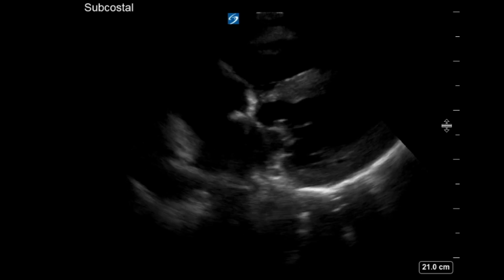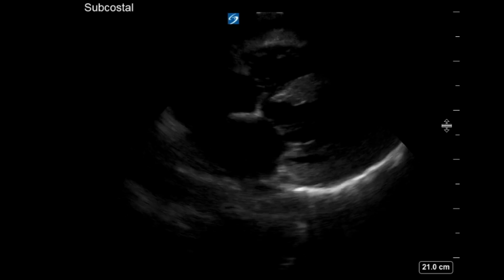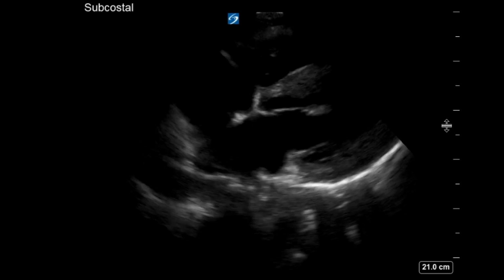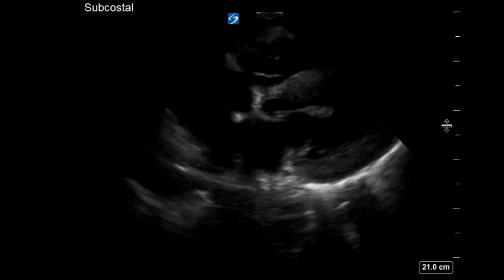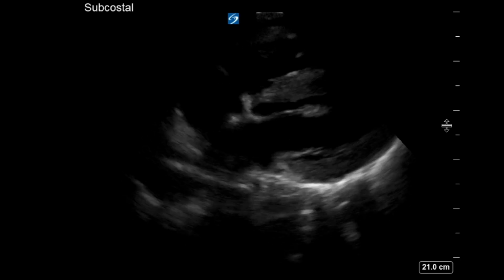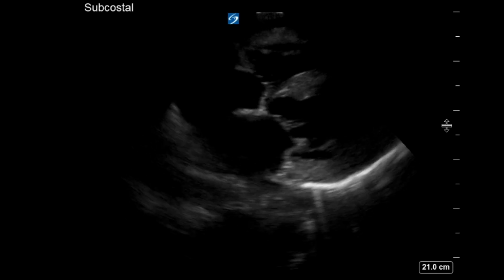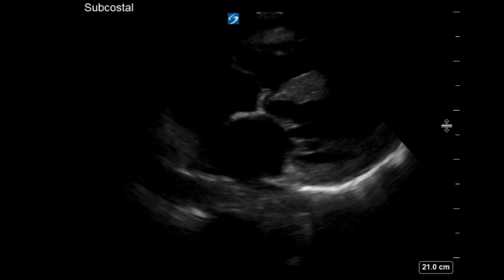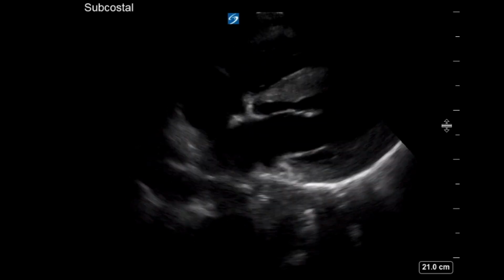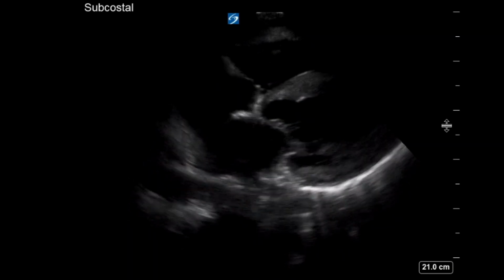So you can have the patient take a deep breath, and another thing you can do is use the liver as an acoustic window because the waves travel pretty smoothly through the liver. So you can go a little bit more right, but then still aiming towards the heart. Right. Yeah, I think that positioning really helps, just having them lay down flat. Taking a deep breath in is going to contract the diaphragm down. The heart's basically sitting on top of the diaphragm, and then it will move down towards your probe with it, more towards the abdominal cavity, and get you a better view.